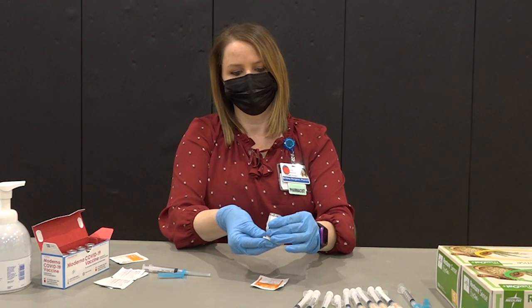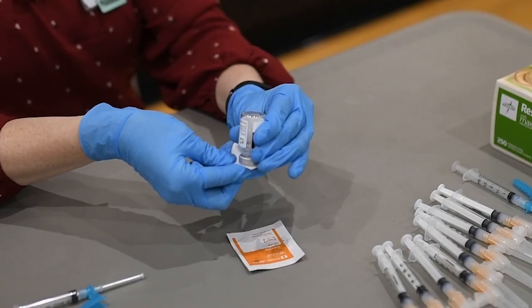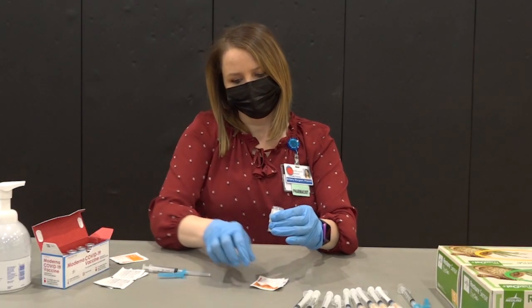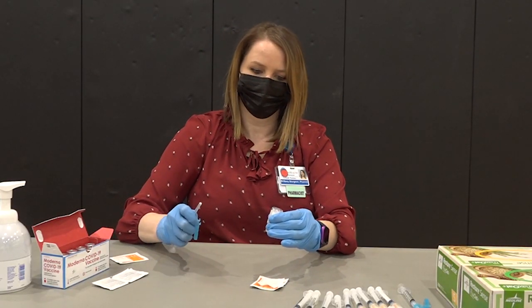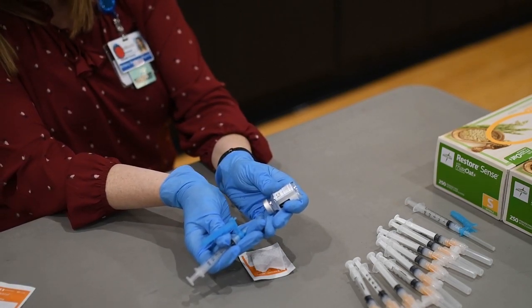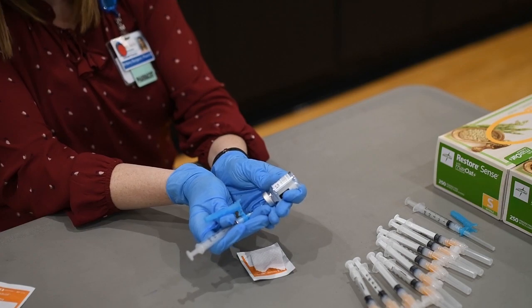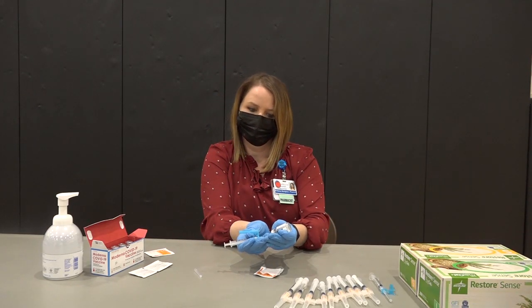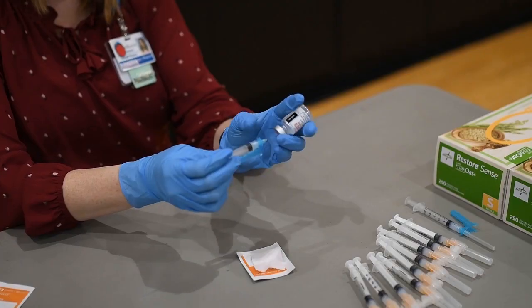Once ready to prepare your 11th dose, make sure that the vial remains inverted and go ahead and re-clean that surface to ensure that no contamination has occurred. Inject your needle at a 45 degree angle to allow for it to rest in the neck of the bottle where the groove meets the neck. If you add a little additional volume of air to the vial, it helps with that suction.